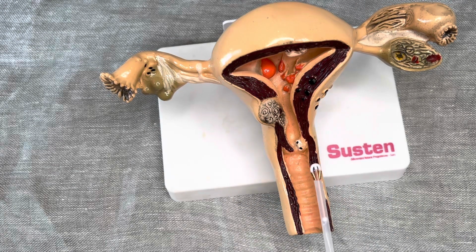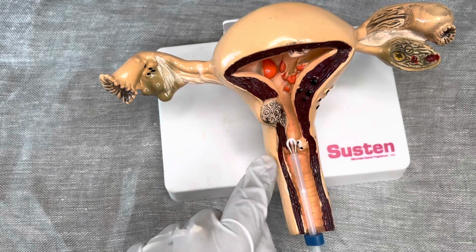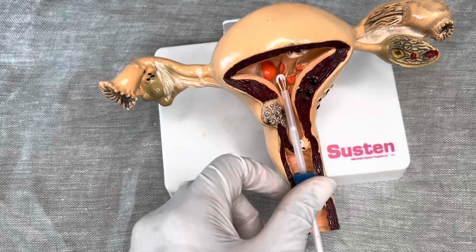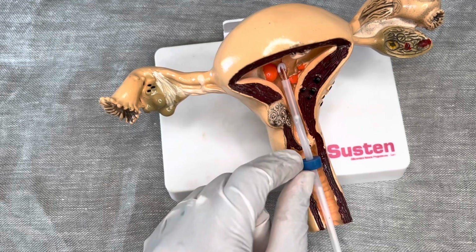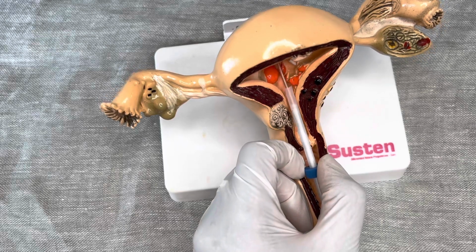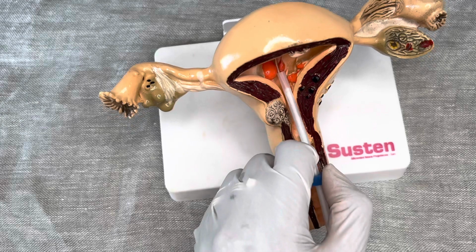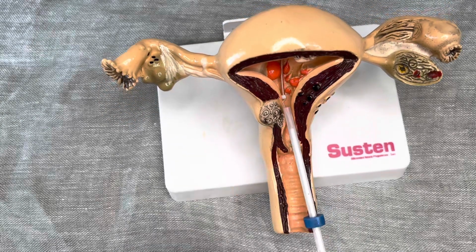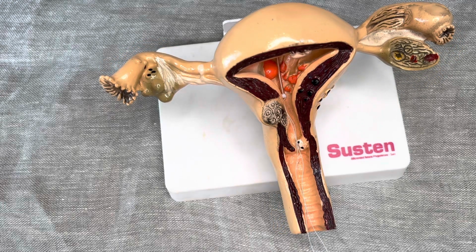Now you introduce it from the vagina while still visualizing where the cervix is. You go in, yeah, and when you're just about to hit that 6th mark where you are supposed to leave, I like to leave a little bit of space there, and then you just push it. Can you see how beautifully that is happening? You just push it like that, yeah. Once you push it, you come out. Shoop. You see? Beautifully. I don't know if you guys can see.